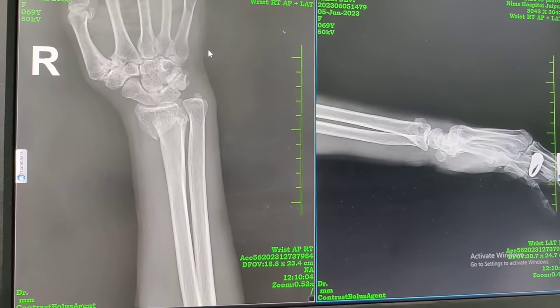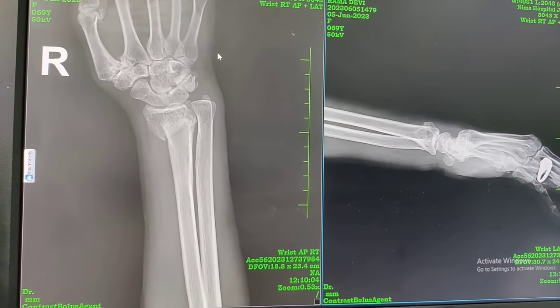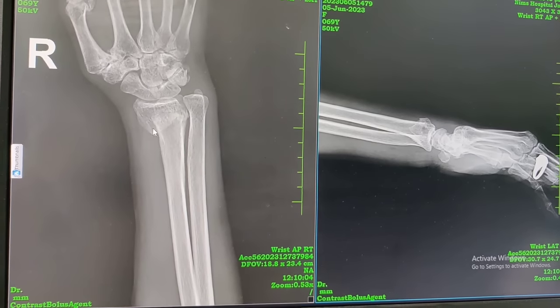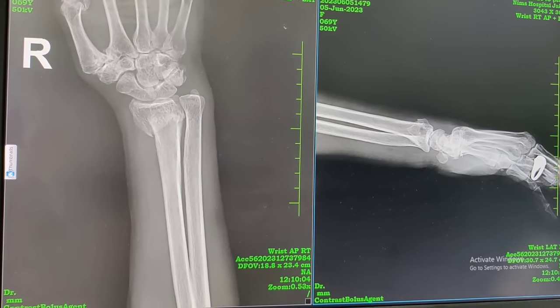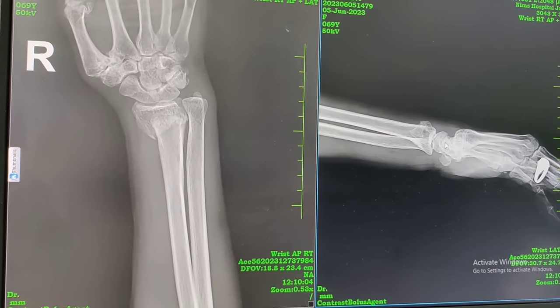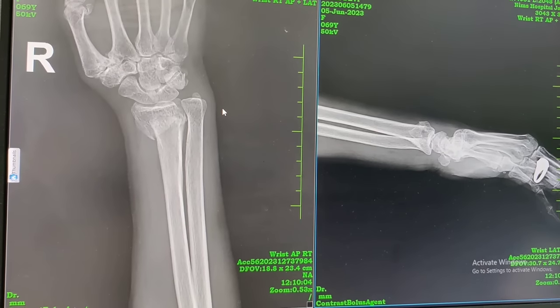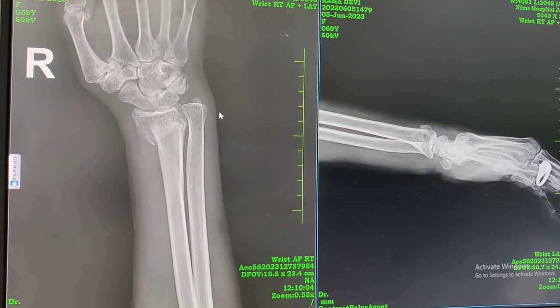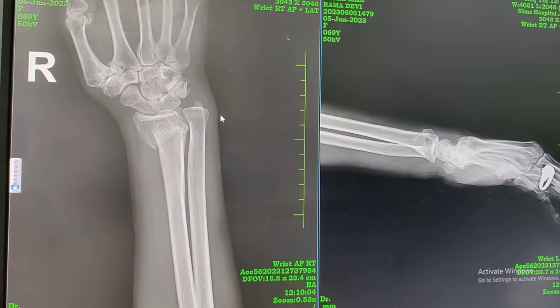This is our patient. She is right-hand dominant. She unfortunately fell and on AP you can see she has got an extra-articular fracture of the distal radius, and the same is seen on the lateral. She is around 70, so we are planning to do a closed reduction and K-wire fixation for her.